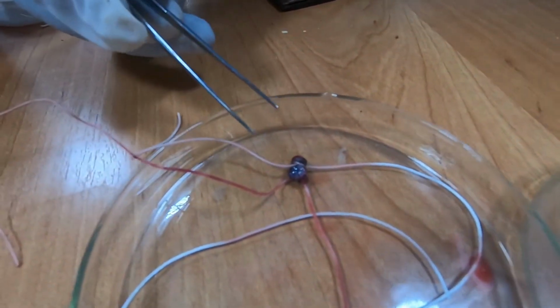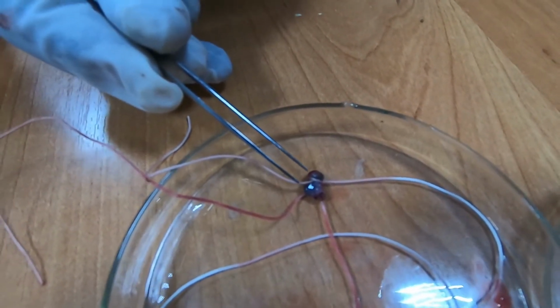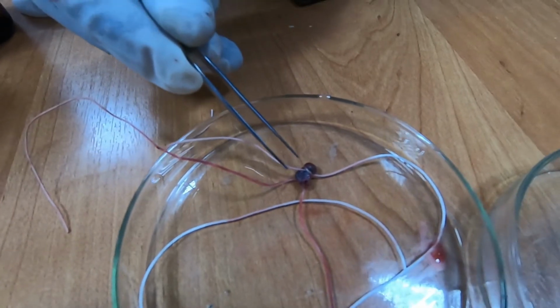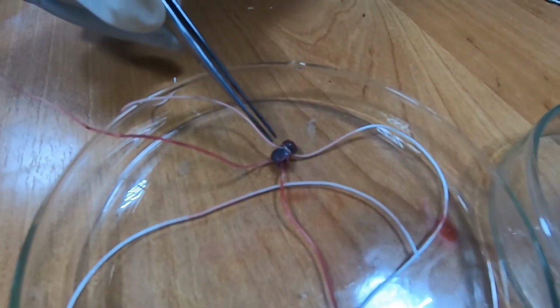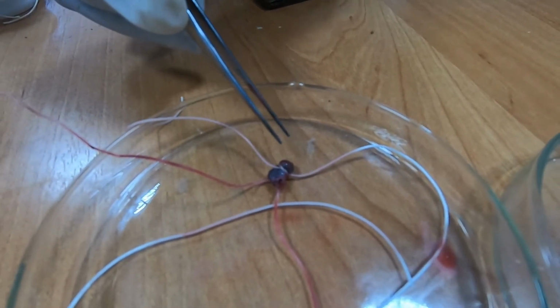Okay, dear students, you see we have divided into two, the lower part and the upper part. As you can see, it's still beating, so we just have to add more adrenaline for you to see it much better. The upper part is beating. You can see it's moving. And just check the lower part.